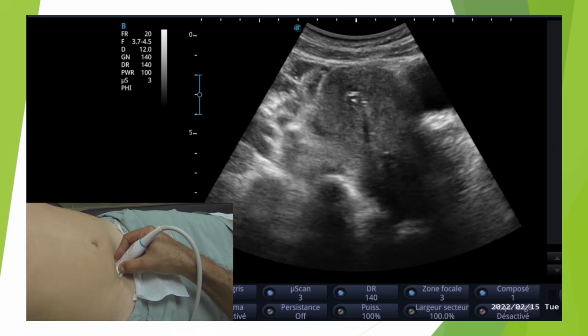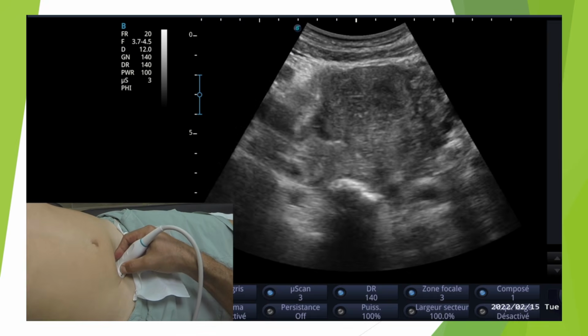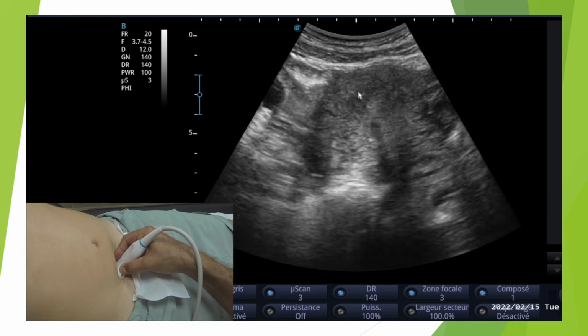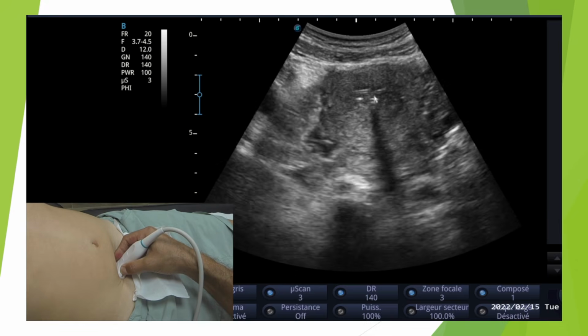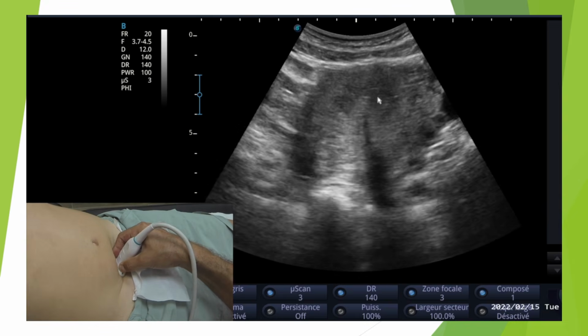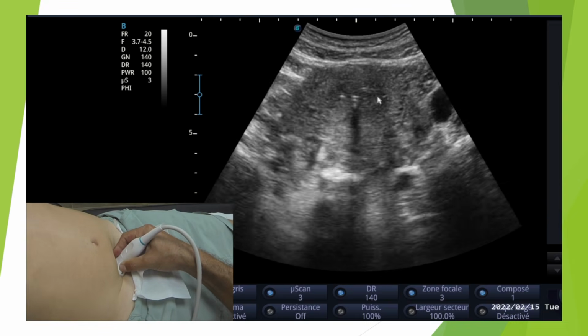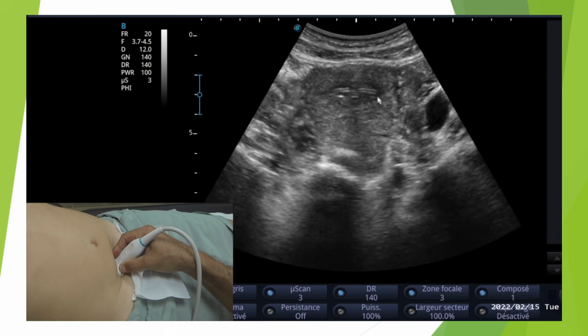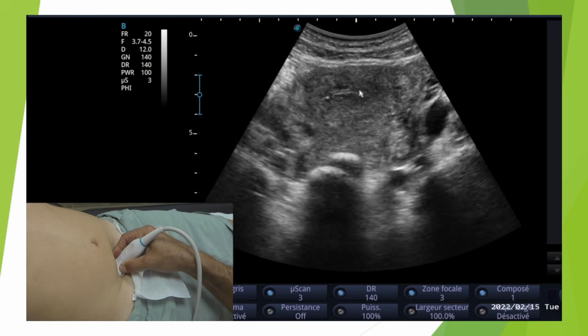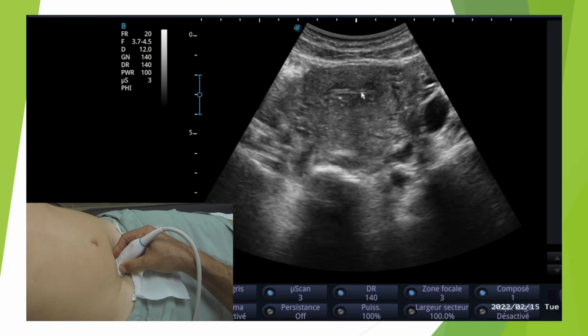In this cross-section, you can see the arms of the IUD appear, both arms of the IUD, the right arm here and the left arm, with the central part of our IUD right here. And we're simply going to check on a cross-sectional view that our IUD, first, that the arms are fully open like here. You can see that our arms are nicely open at the fundus of the uterus. And we're also going to check that our IUD is centered within the uterus.